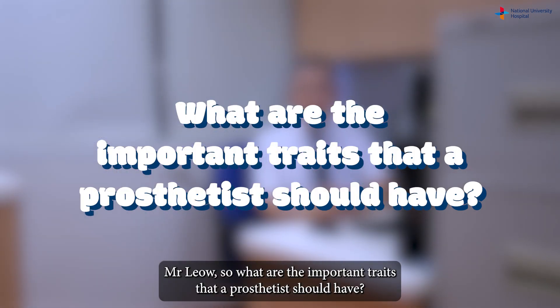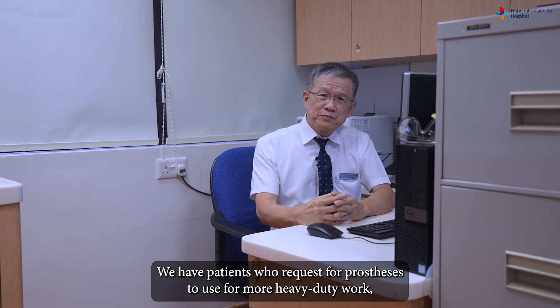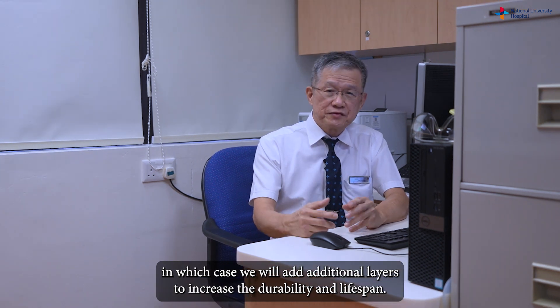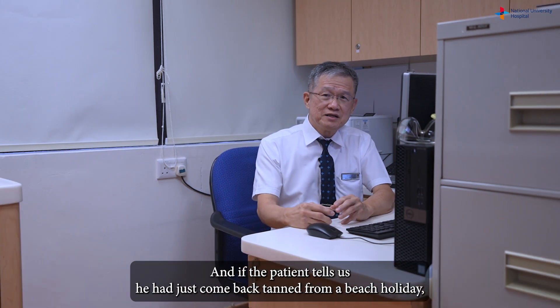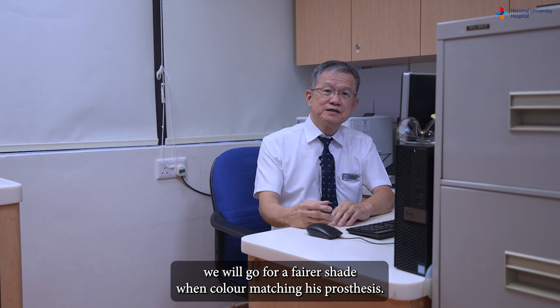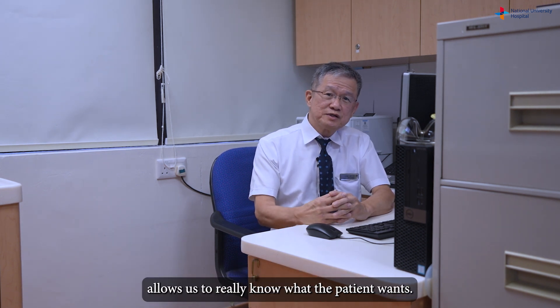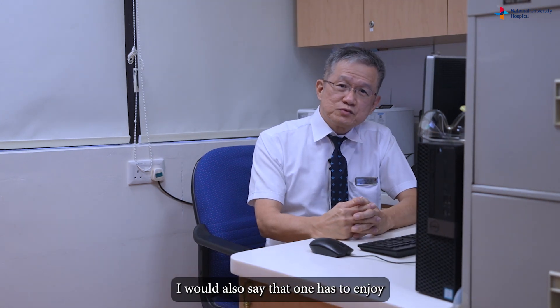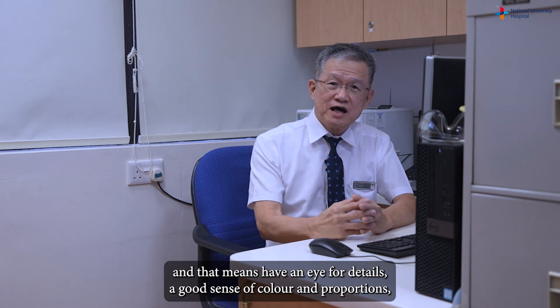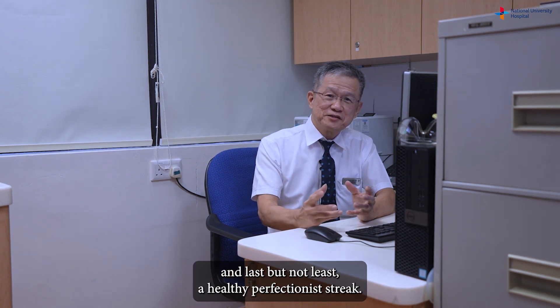What are the important traits that a prosthetist should have? Being a good listener is important in our line of work. We have patients who request prostheses for more heavy-duty work, in which case we add additional layers to increase durability and lifespan. And if a patient tells us he just come back tanned from a beach holiday, we will go for a fairer shade during colour matching. I would also say that one has to enjoy creating and building things, have a good artistic sense — an eye for detail, a good sense of colour and proportions — and last but not least, a healthy perfectionist streak.